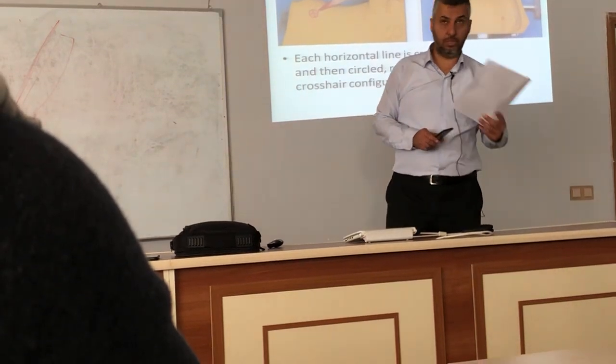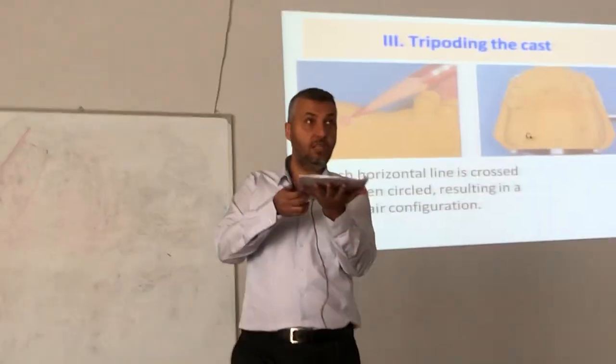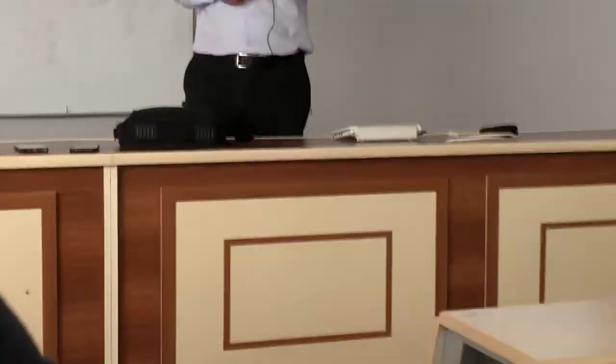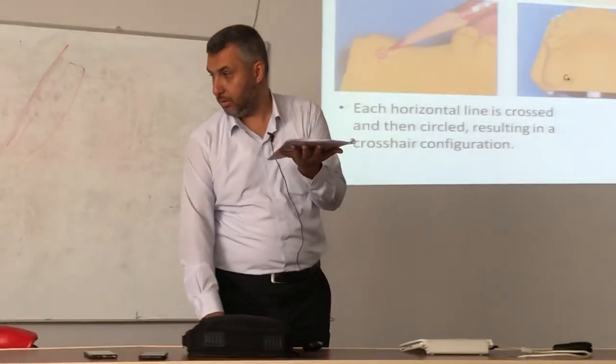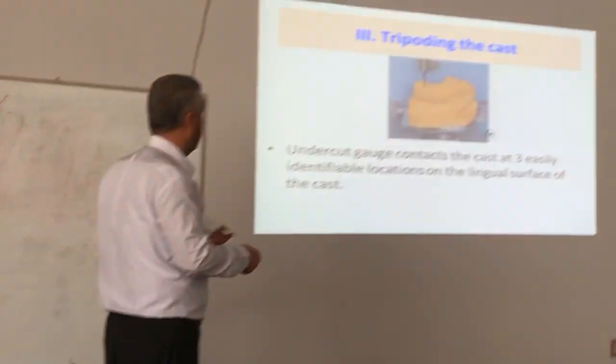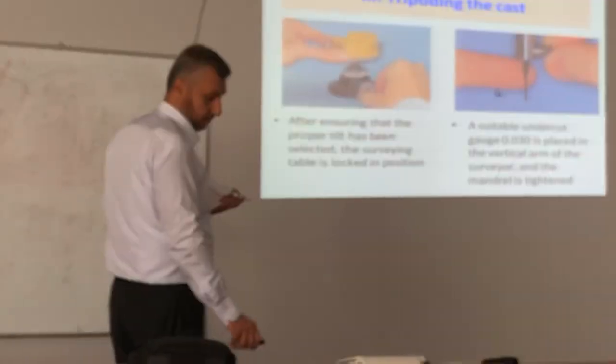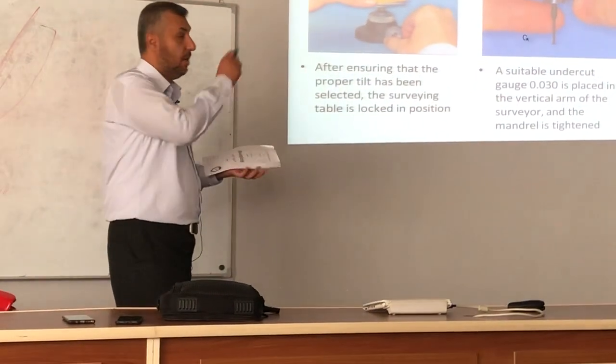What do we do by tripoding? Once I put my cast on the survey table, I have a tool, this one. This is a marker.